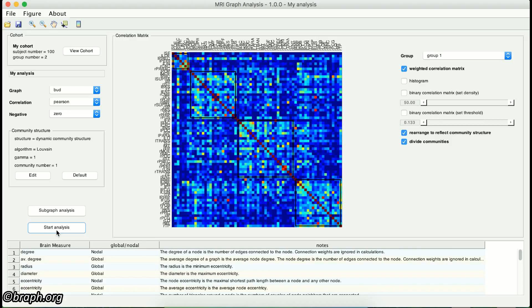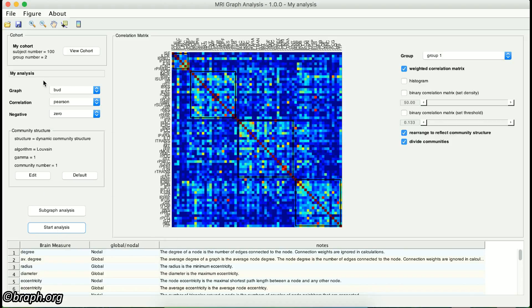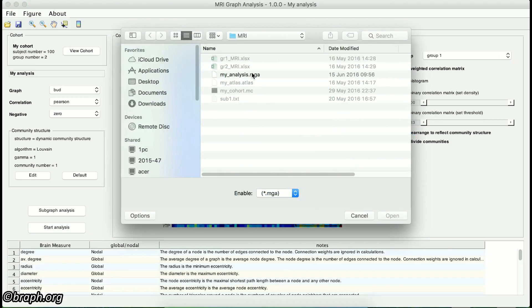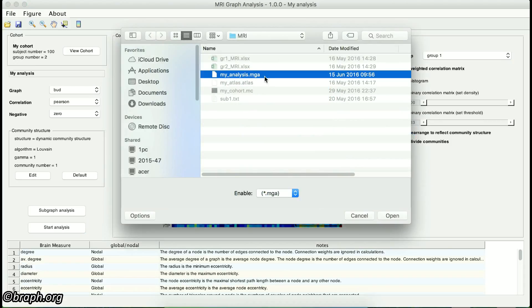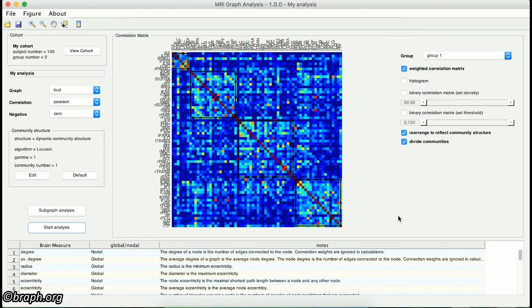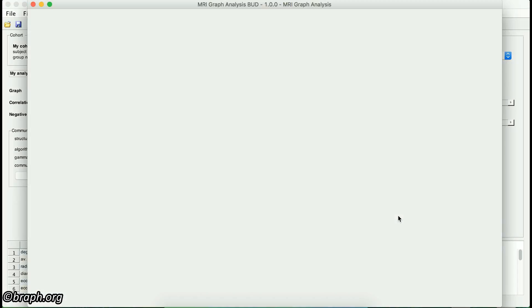Here, we are going to start our analysis on the connectivity matrices of different groups. In order to start your analysis, you can either click on the Start Analysis button, or you can open the saved graph analysis which is saved as a .mga file. Then this interface appears.